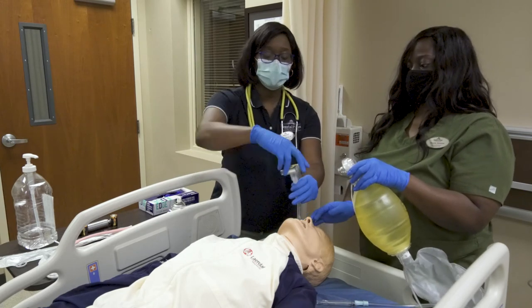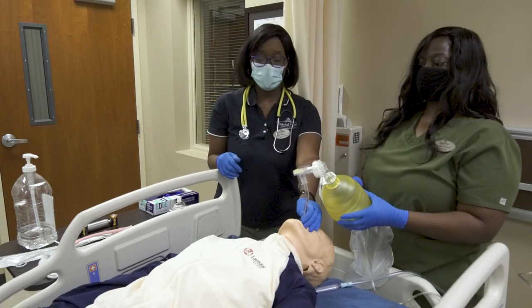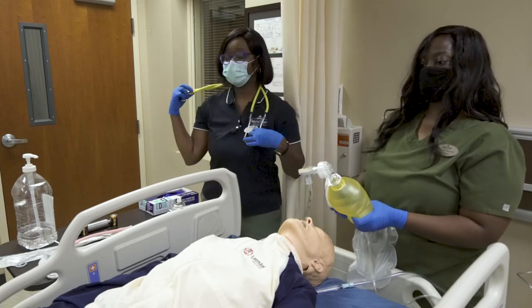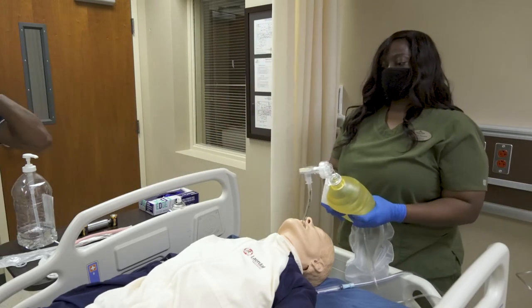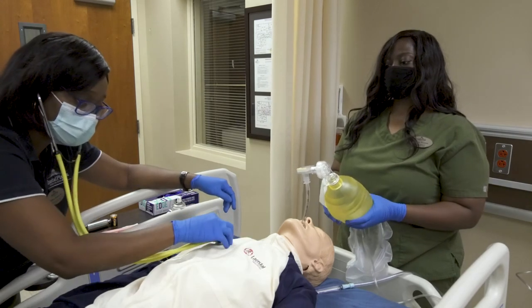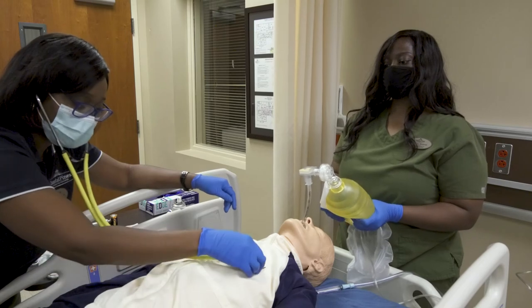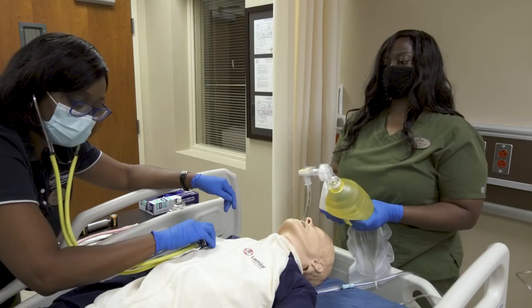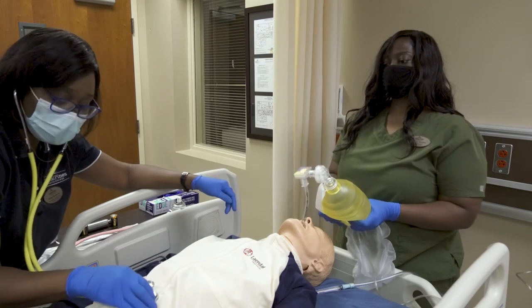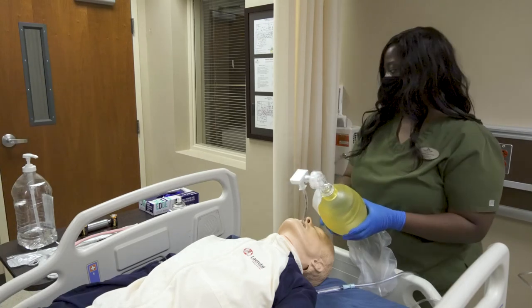After visualizing the ET tube placement, attach your ambu bag and look for chest rise. Make sure you auscultate the chest and listen for bilateral breath sounds. Also auscultate over the epigastric area.